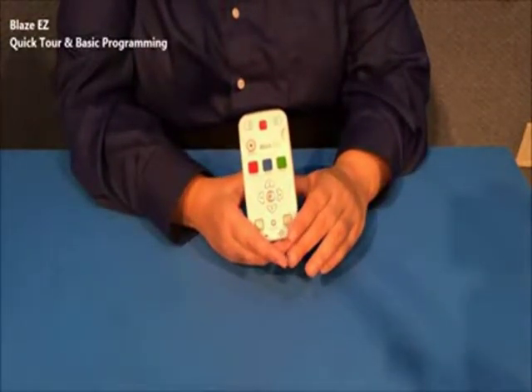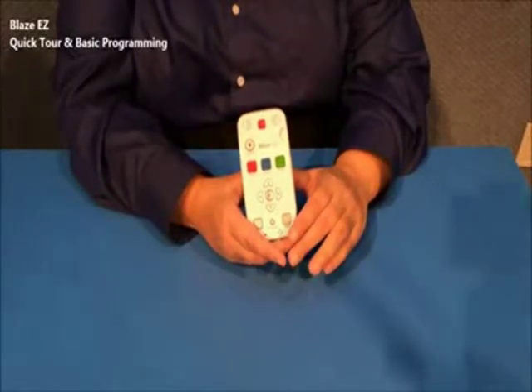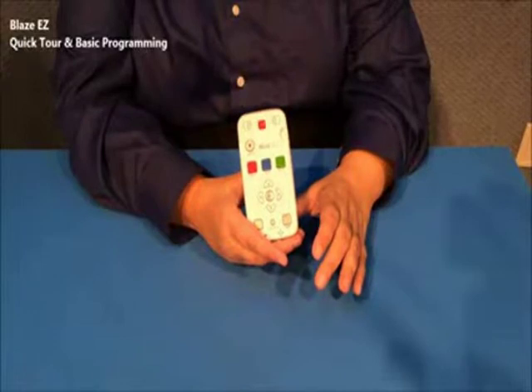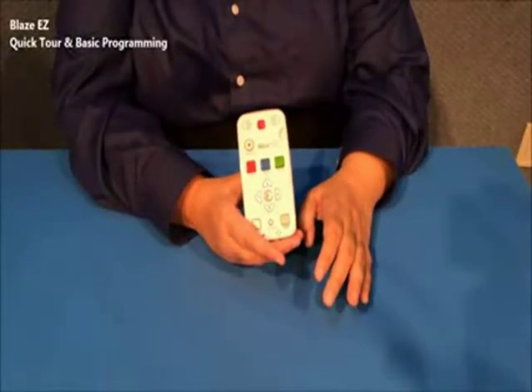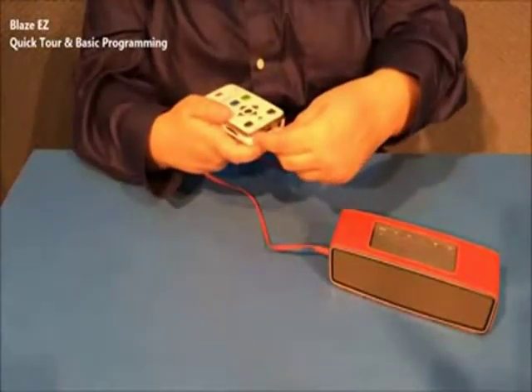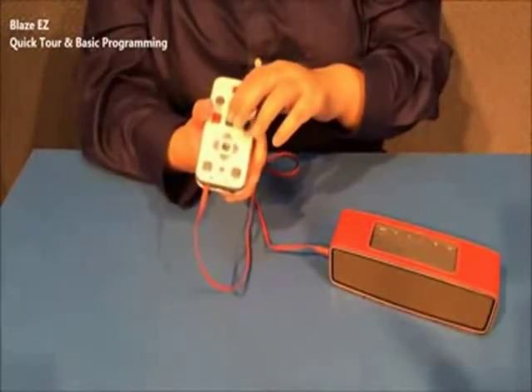6:32 p.m. Monday, October 20th, 2014. And I'm placed back at the Home menu. In the same way, I can press the letter R to open the FM radio. However, before I do that, I'm going to have to make a bit of a change. You have to connect either headphones or a patch cord to a speaker in order to get radio reception, as that cord will serve as the antenna. So I'm going to take a moment and do that now. So I'll plug this in, and now I will press the letter R.